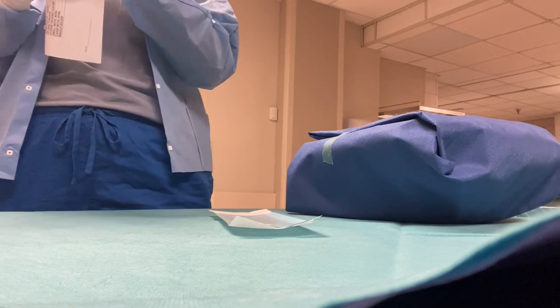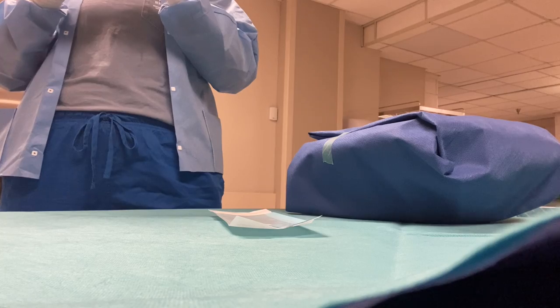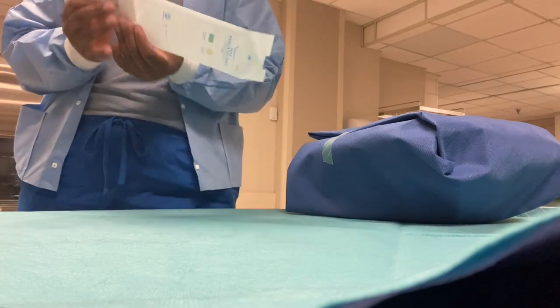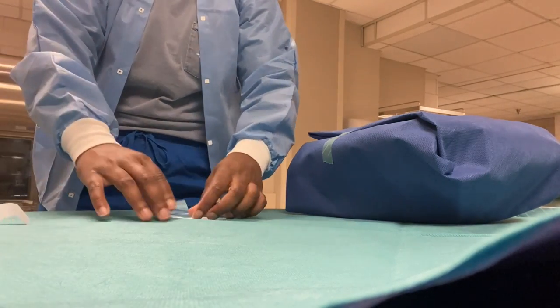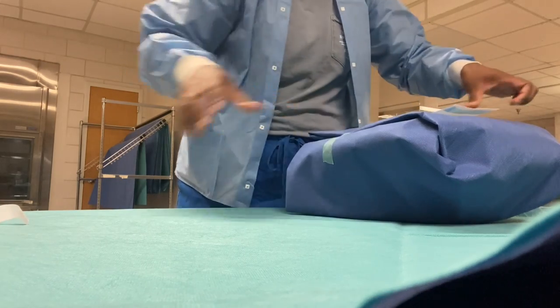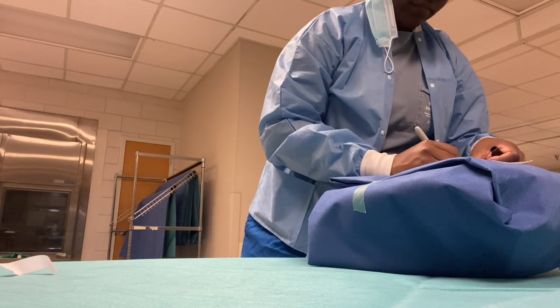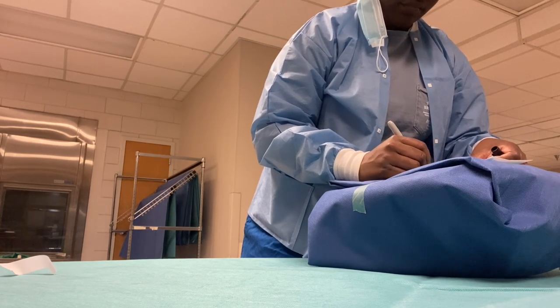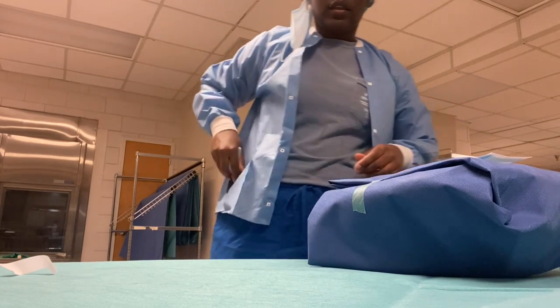Now, fold it neatly. Place inside. Place under the tape. And now I'm gonna just write that name on top of the tape. And that was the pin set.